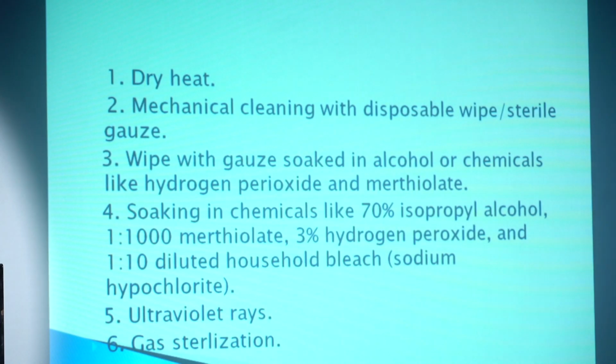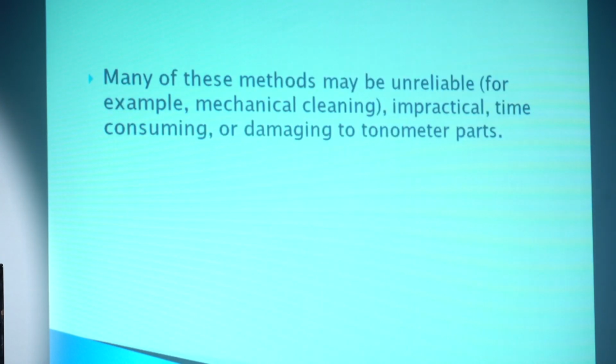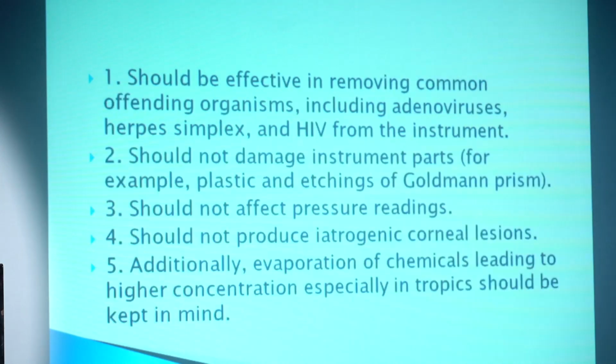Wipes with gauze soaked in alcohol or chemicals like hydrogen peroxide or merthiolate, sometimes ultraviolet rays. These are theoretical, and gas sterilization. Many of these methods may be unreliable, for example mechanical cleaning, and impractical, time consuming or damaging to the tonometer parts. So it should be effective.